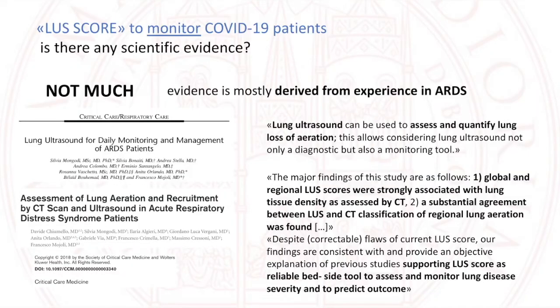So, as said, there is not much scientific evidence, and much is derived from our experience in ARDS. What we know from ARDS patients is that lung ultrasound is quite reliable to predict also what CT would show in these patients, since lung ultrasound is very good to classify the air content of lungs and the tissue density of lungs. So there is a quite good agreement between the two techniques.